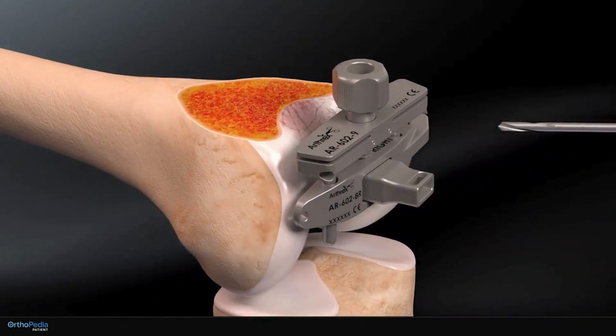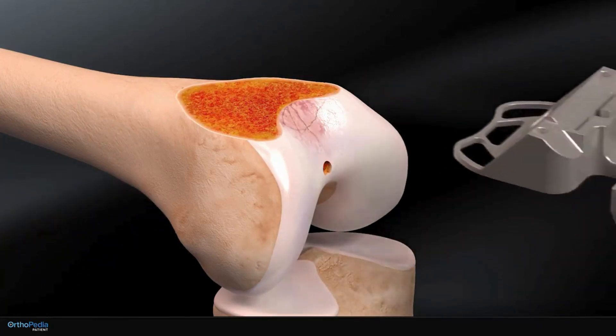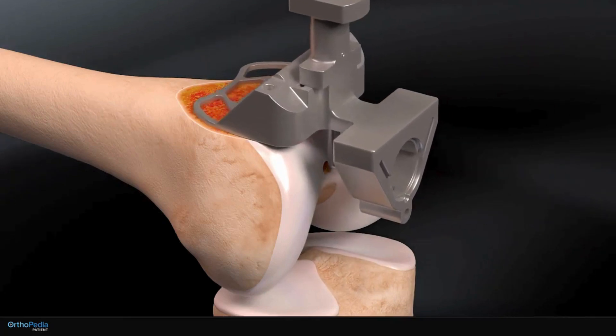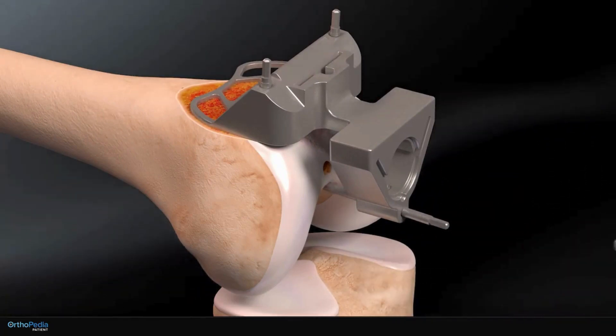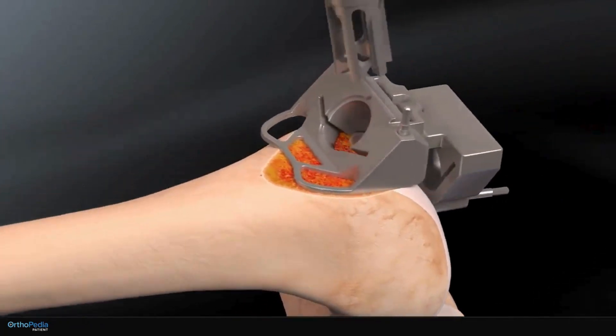Next, the guide and instruments are removed and another sizing guide is placed over the end of the thigh bone. The guide is held in place with metal pins and a reamer is inserted through the openings in the guide to remove more bone from the thigh bone.